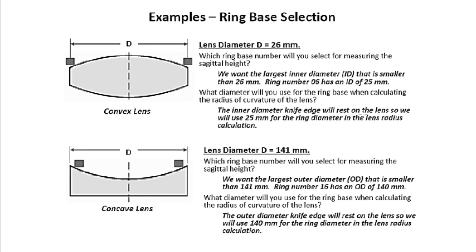So make sure that you understand the foundation of the mathematical model, and do not get confused no matter what terms the problem is using. Use your intellect to differentiate different symbols and terms. We have your radius, which is the curvature of the lens, and then we have the height, which is the sagittal height, which is the tip of your lens to the base of that, and then you have your diameter, which is the inner or outer diameter of that base.